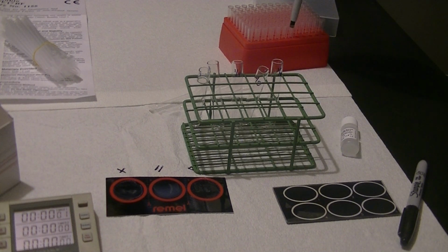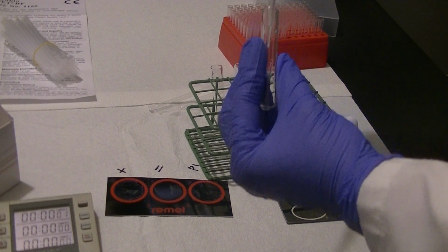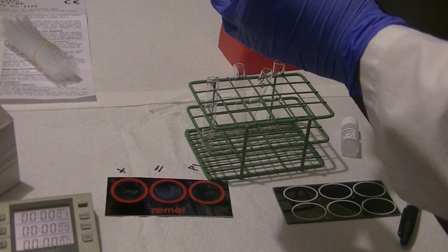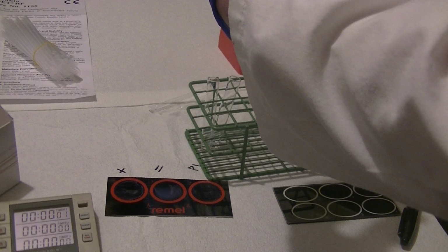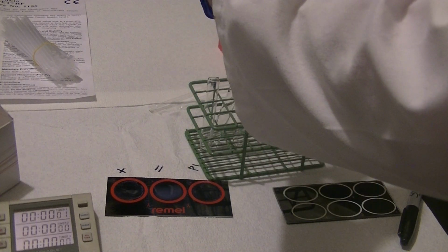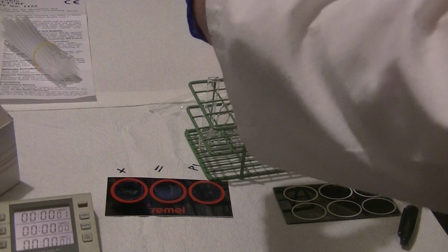Okay. Next, I'm going to add 20 microliters of undiluted patient sample to the first tube to make the 1 to 2 dilution. I now have a total of 40 microliters. Taking 20 microliters and transferring it to the second tube, transferring it to the third tube, and then transferring 20 microliters to the fourth tube. Okay.